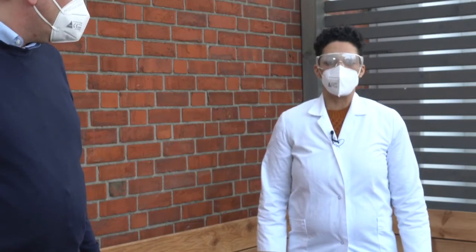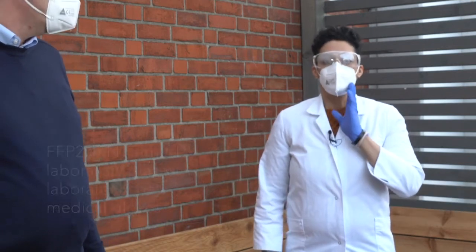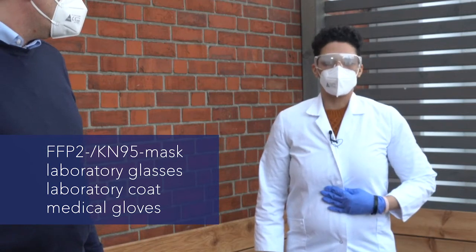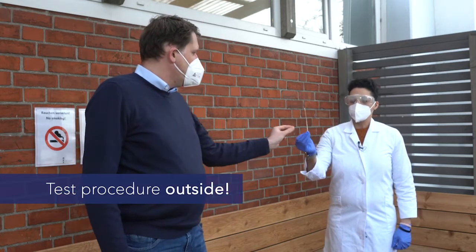Hello everybody, today I would like to show you the new Abbott rapid test, so the nasal swab. In order to perform the test, you would need nose-mouth protection, laboratory glasses, a laboratory coat, and also medical gloves.